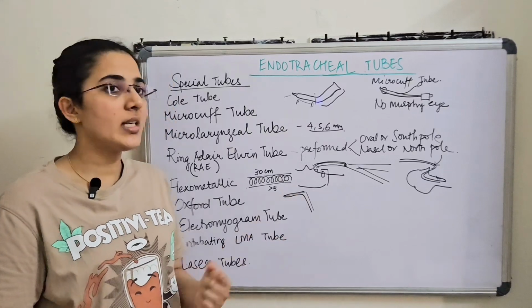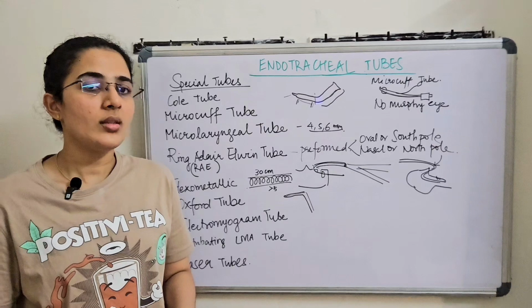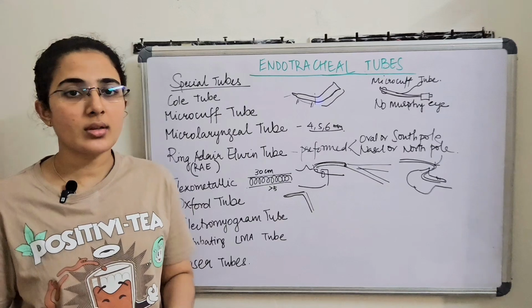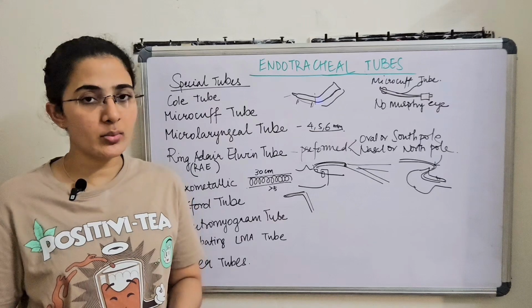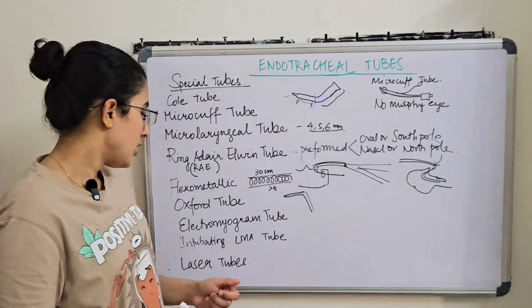Because these were made up of rubber, there were increased chances of latex allergies. Also, they could be cleaned, washed, and reused. They were used because of their fixed length. They were also more prone to endobronchial intubations or accidental extubations.